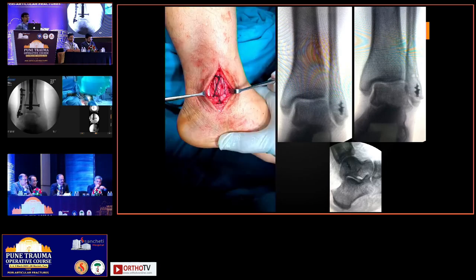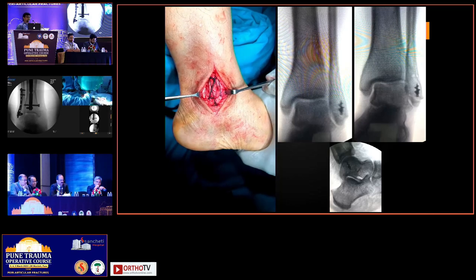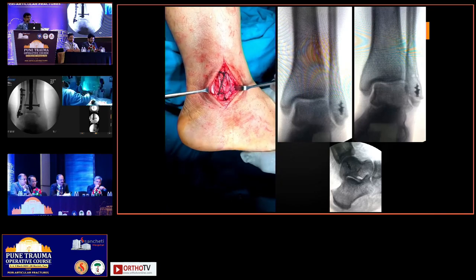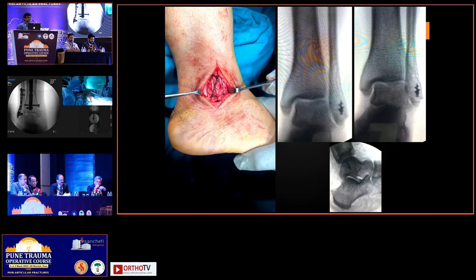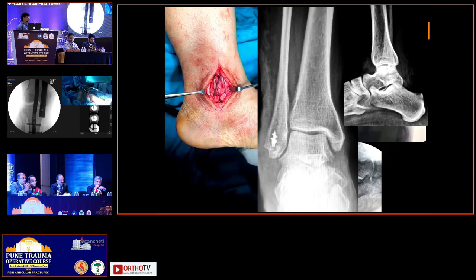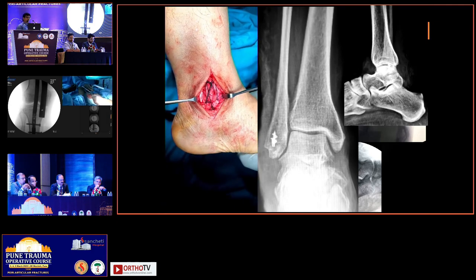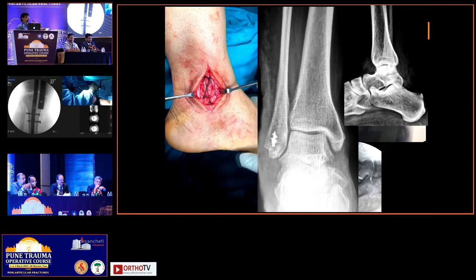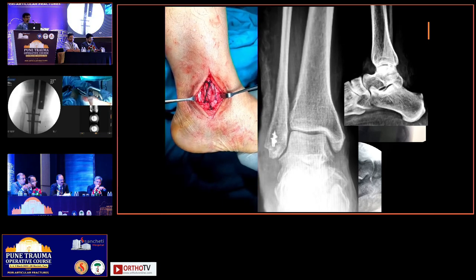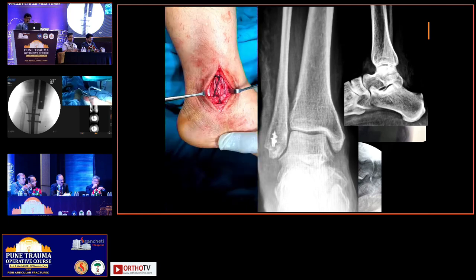It was a simple case of non-union lateral malleolus Weber type A. There was nothing complicated in this. So this was a good idea to do it, and the fracture was very nicely compressed, and that's the post-op x-ray. And everything fell in place. It was absolutely stable, I asked the patient to come for follow-up, but she did not come. She had no complaint, no problem, and the fracture has united.